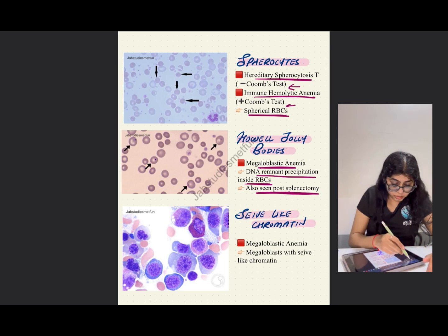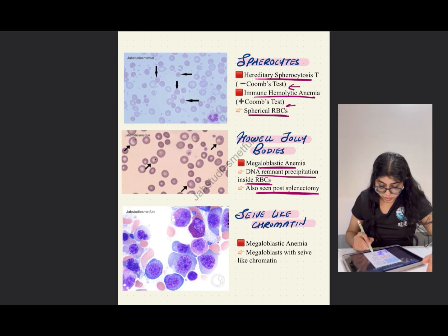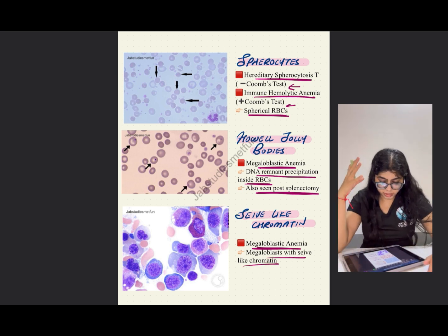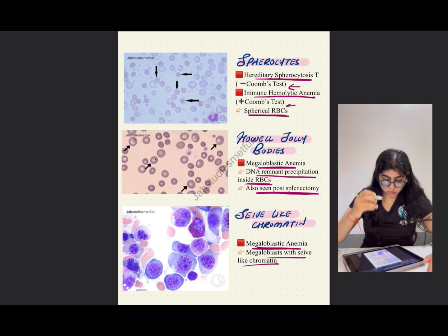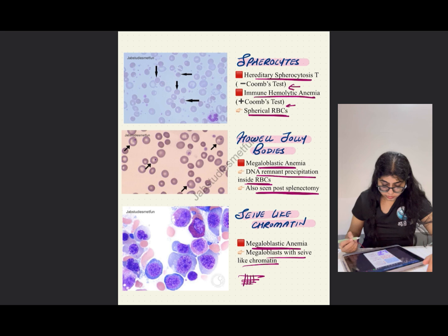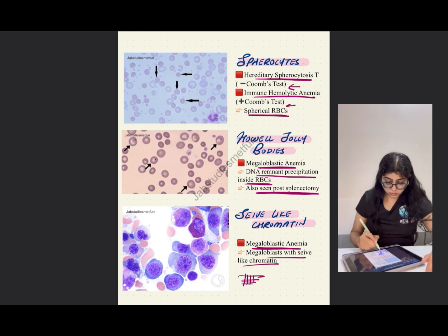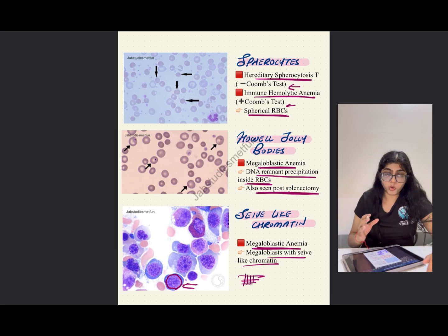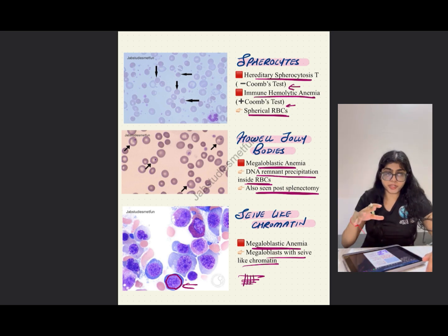Sieve-like chromatin is seen in megaloblastic anemia. Megaloblasts with sieve-like chromatin can be seen in this particular kind of anemia. The chromatin mostly occupies the whole cell and looks like a sieve is present over there.